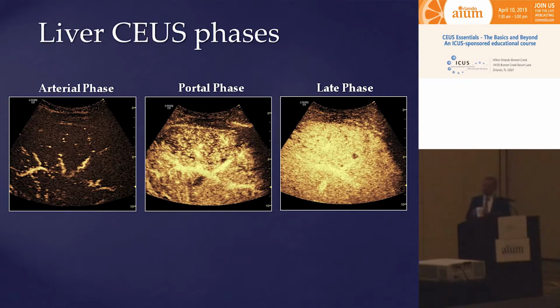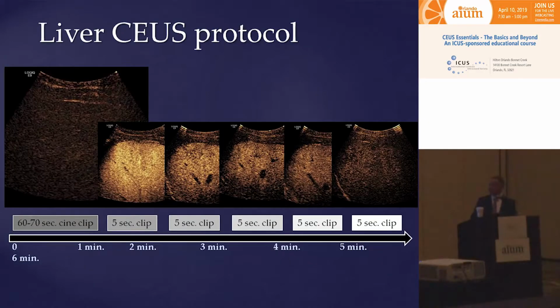Contrast-enhanced ultrasound has an extremely high frame rate, somewhere from 9 to 15 frames per second, much higher than any other imaging modality that we can use to image the liver. So you're going to have very beautiful phases. You can track them with the hepatic arterial phase, then portal venous phase with enhancement of the portal veins and dark, unopacified hepatic veins at this point, and then late phase with filling of the entire liver with contrast.